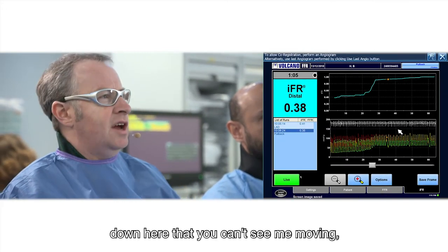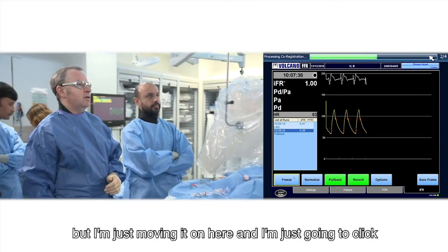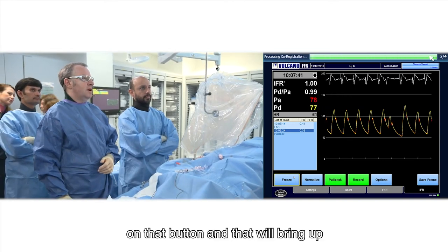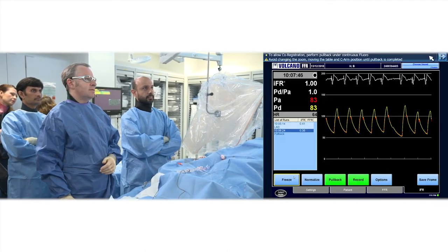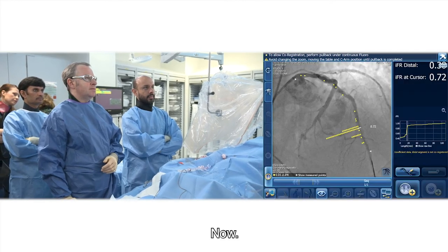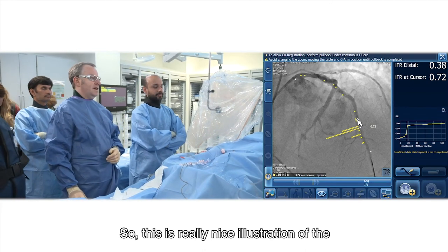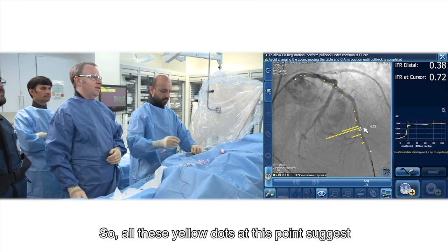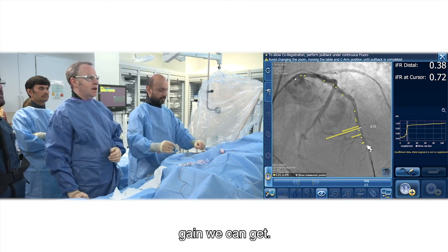Great, so now that's screen clear. I've got a joystick down here that you can't see me moving, but I'm just moving it out here. And I'm just going to click on that button, and then that will bring up the SyncVision co-registration. Now, so this is a really nice illustration of the use of this system. So all these yellow dots at this point suggest this is where the maximum benefit or the maximum delta gain we can get.